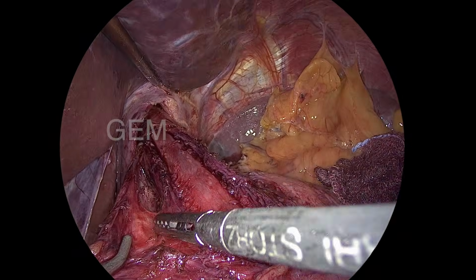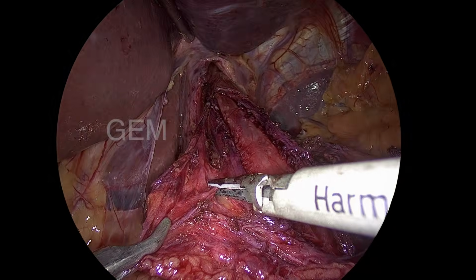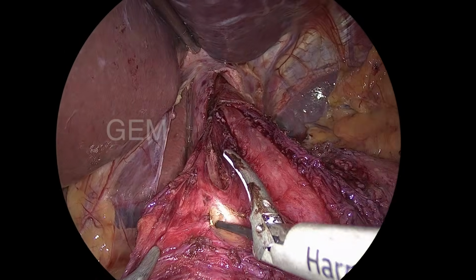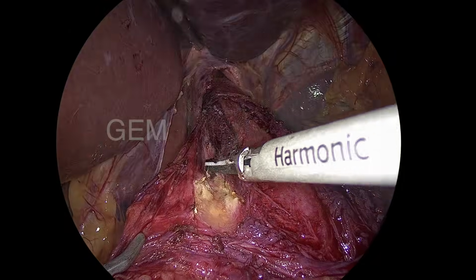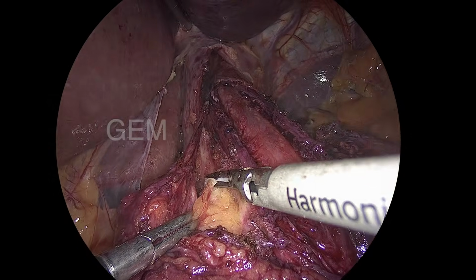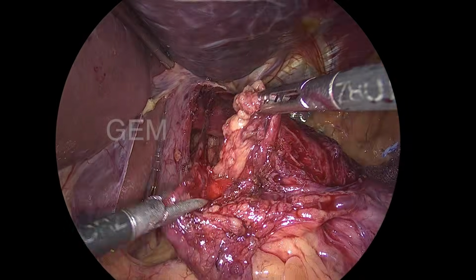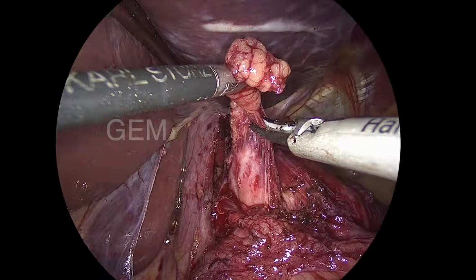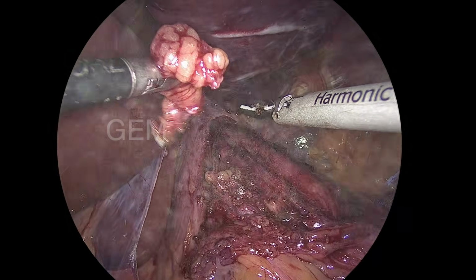So, here I am taking this fundus between the esophagus and the anterior vagus. For that I mobilize this vagus a little bit to the right side, so that the fundus will come here. The Toupet I can do very comfortably. Do not keep it over the vagus. This is the extra fat or greater omentum side.